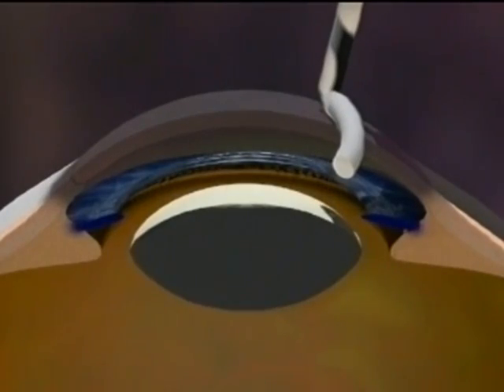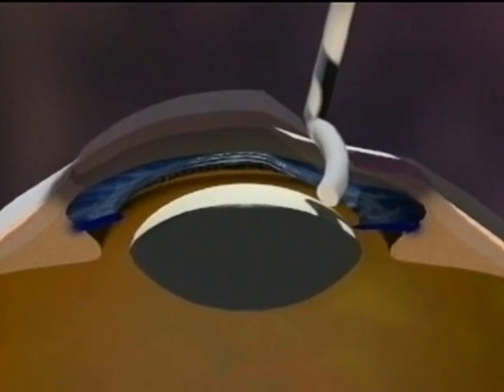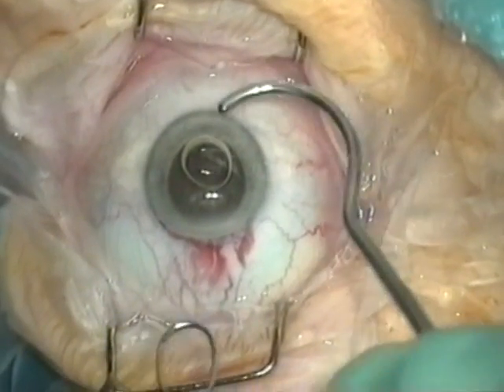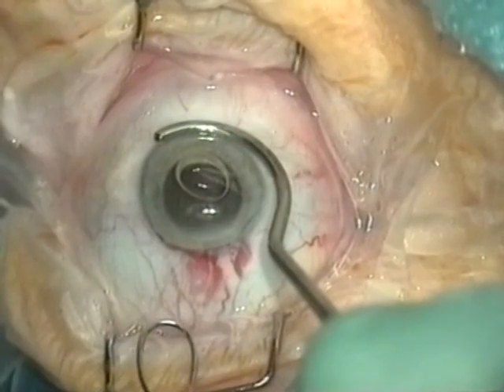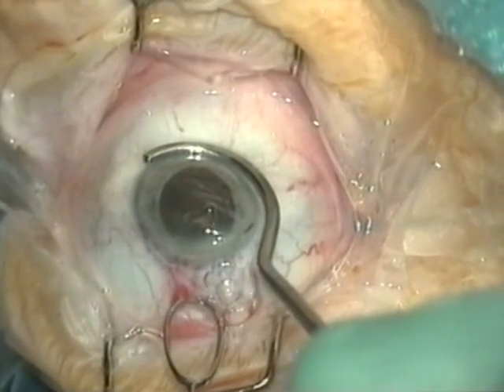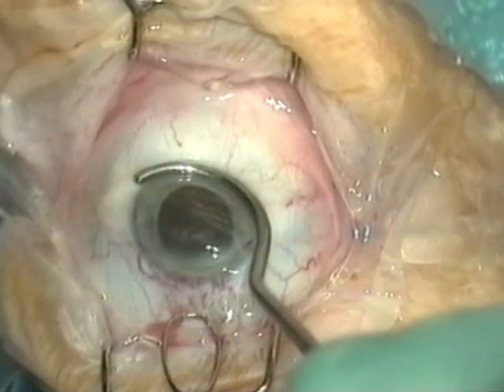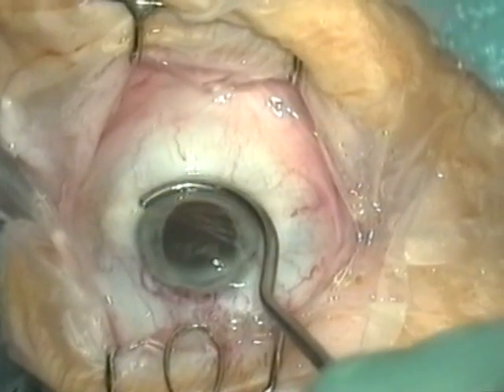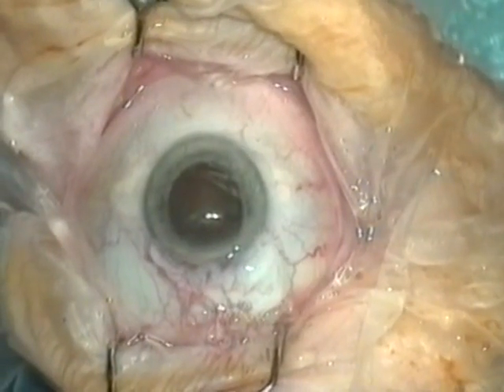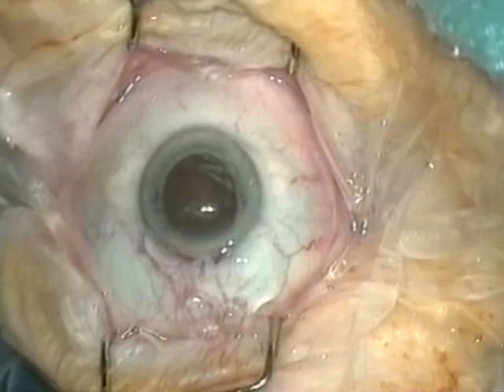If the expressor presses down on the cornea, the corneal endothelium can be damaged. Sometimes the nucleus may not come out of the eye. There can be four possible reasons for this: the incision might be too small, the pupil might be too small, the hole in the capsule might be too small, or the lens nucleus might be very large.